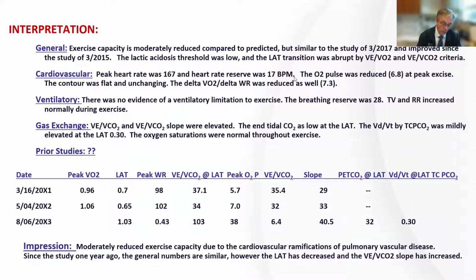Okay, so what you're going to do is transmit this information to your provider. So the first question is always, who sent you the referral? Are they sophisticated in exercise testing? Let's say they're a pulmonologist or a cardiologist that does this all the time. I'm probably going to state what I think is going on, but not go into a lot of detail. If it's somebody that isn't normally understanding cardiopulmonary exercise testing, this last line, what your impression is, I think is very important. But I'd like to put down, dissect that a little more.